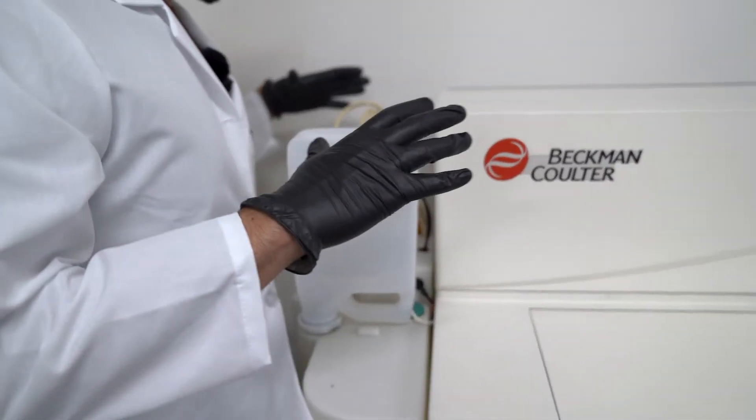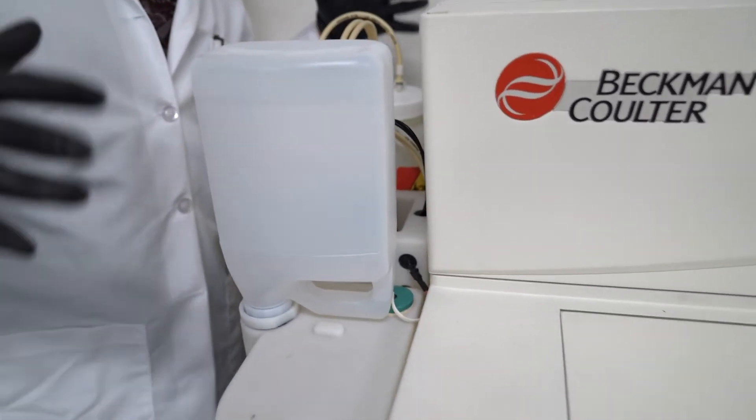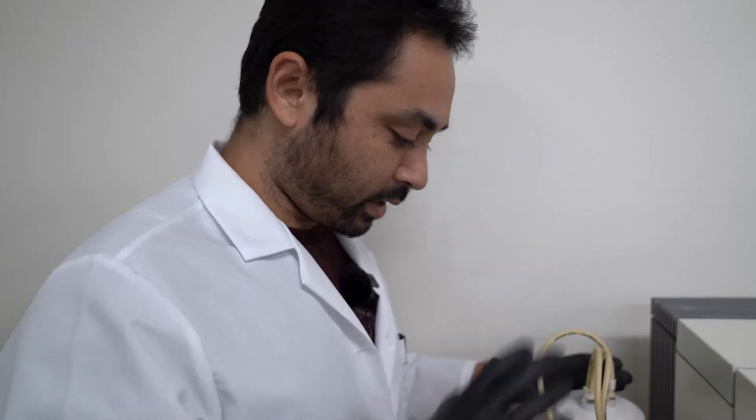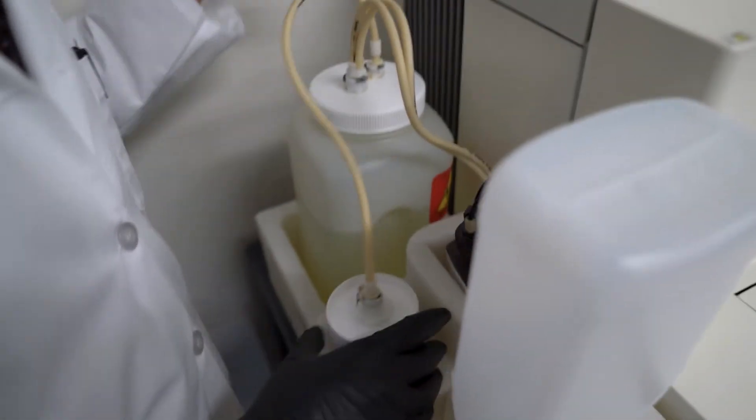Here we just want to check out the fluidic module. The fluidic module is essentially just the bottles, so check that there are no leakages here and you're good.